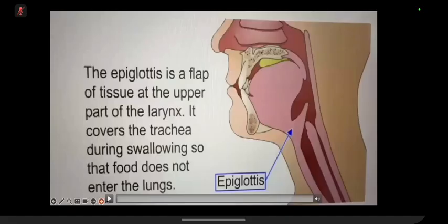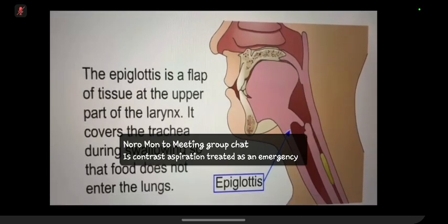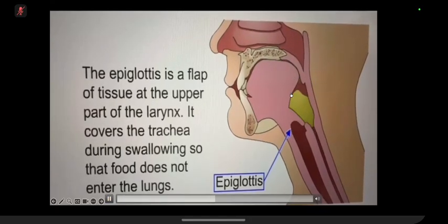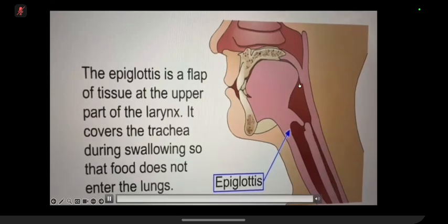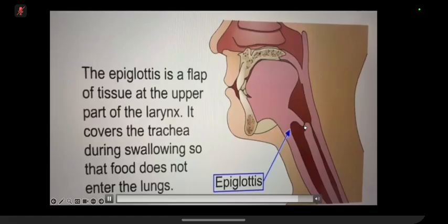This is the video which I would like to show you people, how the normal swallowing mechanism works. You can see clearly that the food bolus comes here and everything is synced. All the muscles of the oropharynx, all the muscles of the larynx, work in a synchronized manner to push that bolus. The epiglottis immediately covers to avoid aspiration in the trachea. In the normal mechanism, it covers entirely. In the abnormal mechanism, it might be weak, it might not cover entirely, as in this scenario as well. Okay, so next case.